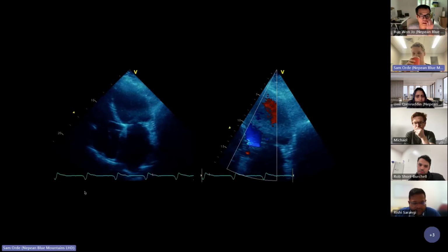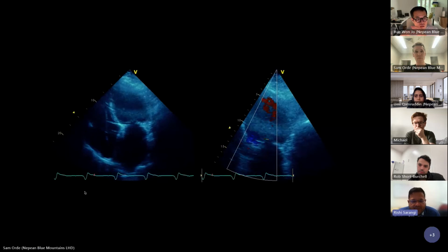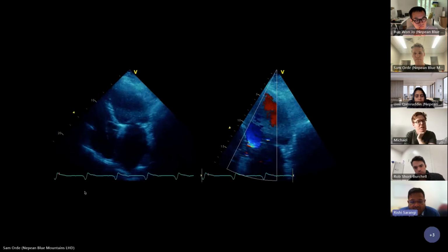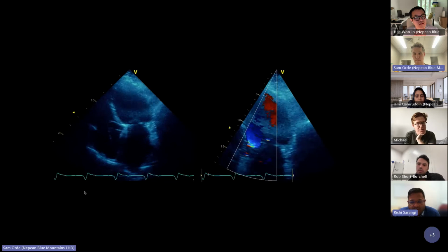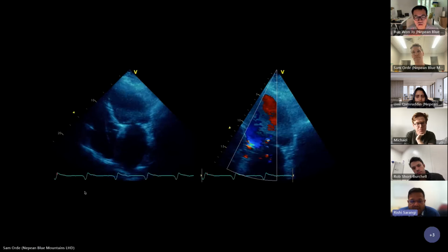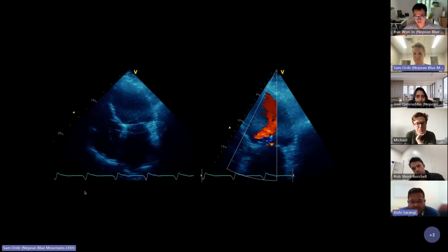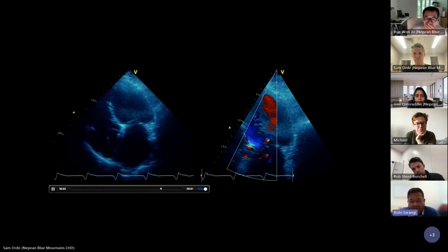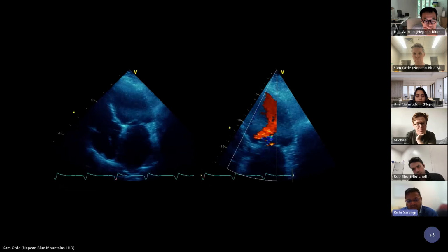Give me some ways. So first is subjective assessment from whatever image we have. Anything else? Then objective measurements. We have a color Doppler. We can measure a VTI through that. Endocardial definition is not that well assessed, and we are losing part of the apex in both the views. So Simpson's biplane might be challenging. Using contrast to see if we can get a better definition, optimizing the image with the 2D imaging while doing it as much as possible to get the apex in picture and to make sure we are not foreshortening.